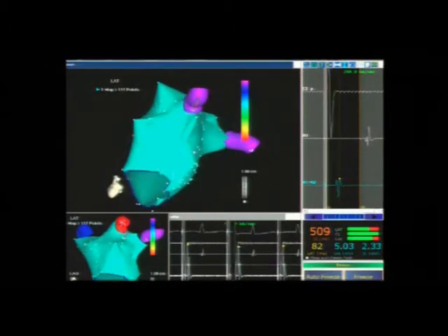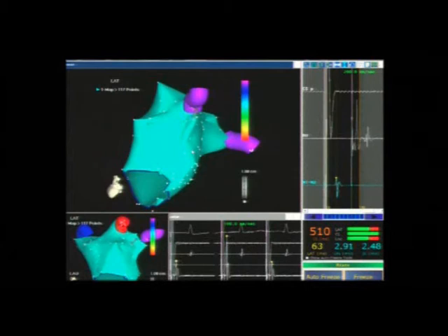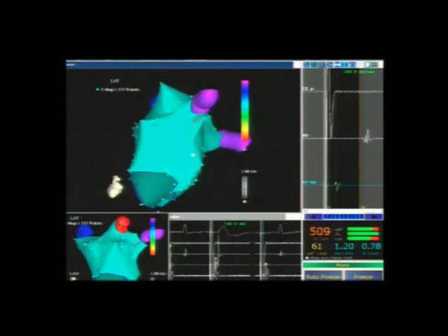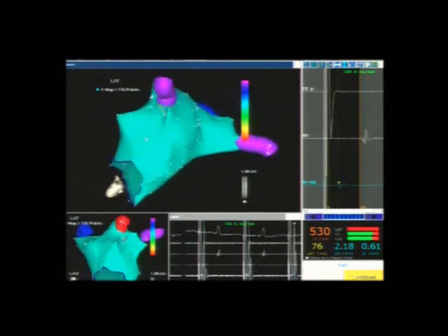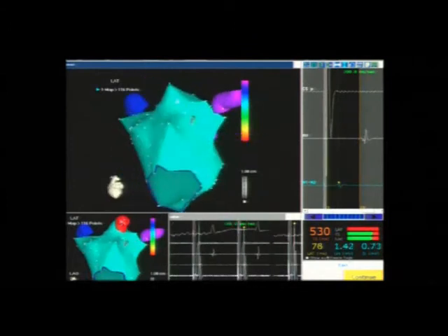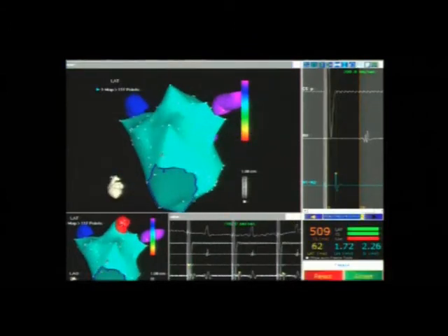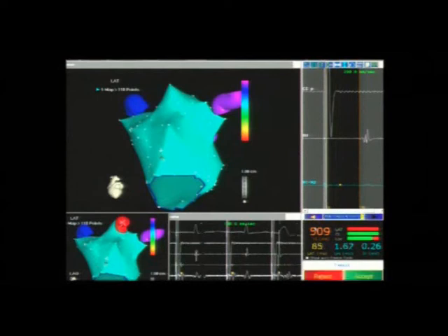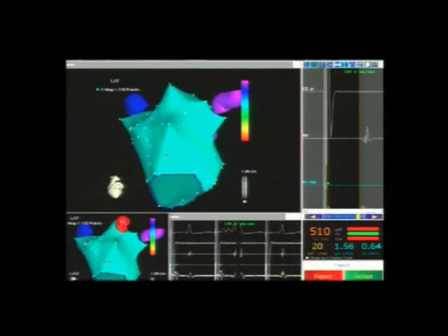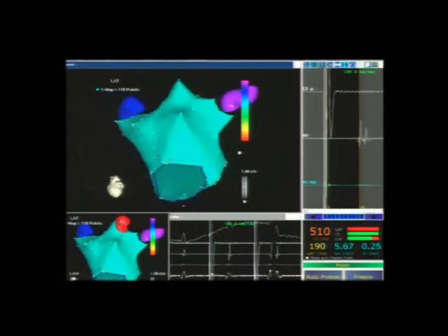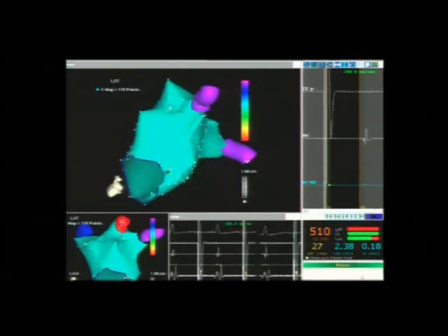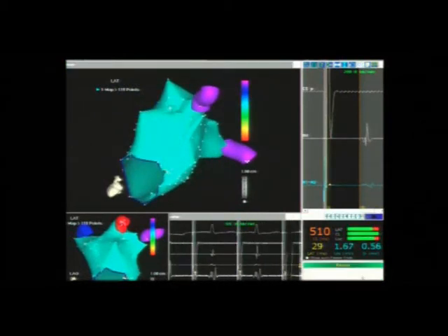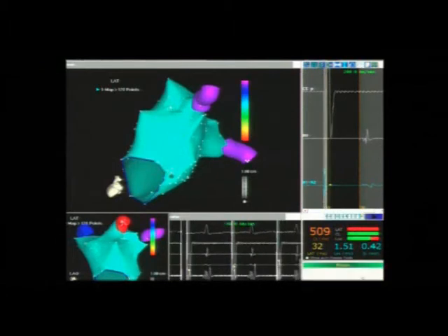Unlike manually mapped atria, the auto mapping system allows reaching every site of the atrium, even the most challenging ones such as the ridge, the left atrial appendage, the mitral isthmus, and the septal region. This results in a uniformly accurate acquisition of the left atrial anatomy, which is a fundamental step in the ablative strategy of atrial fibrillation.